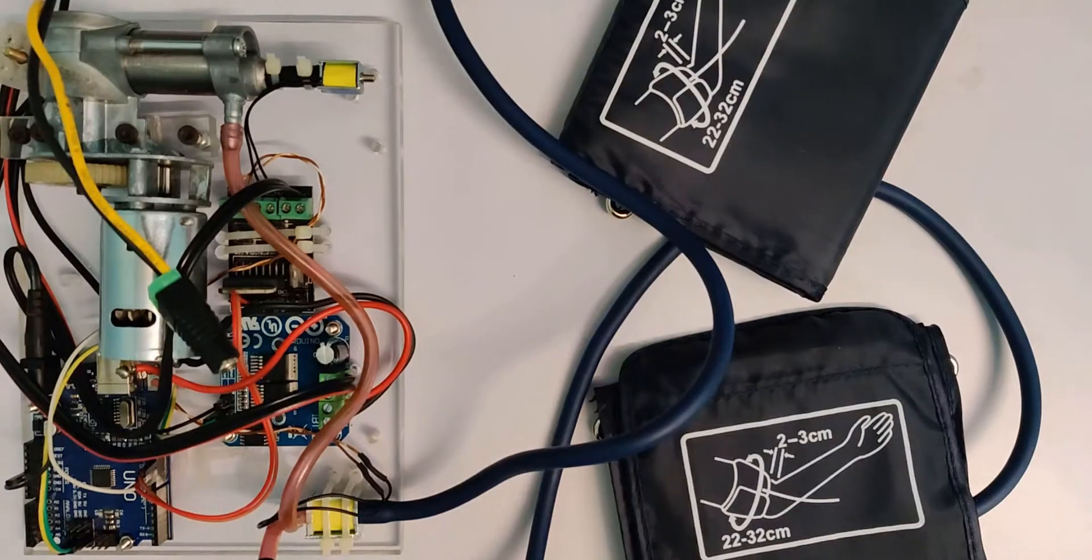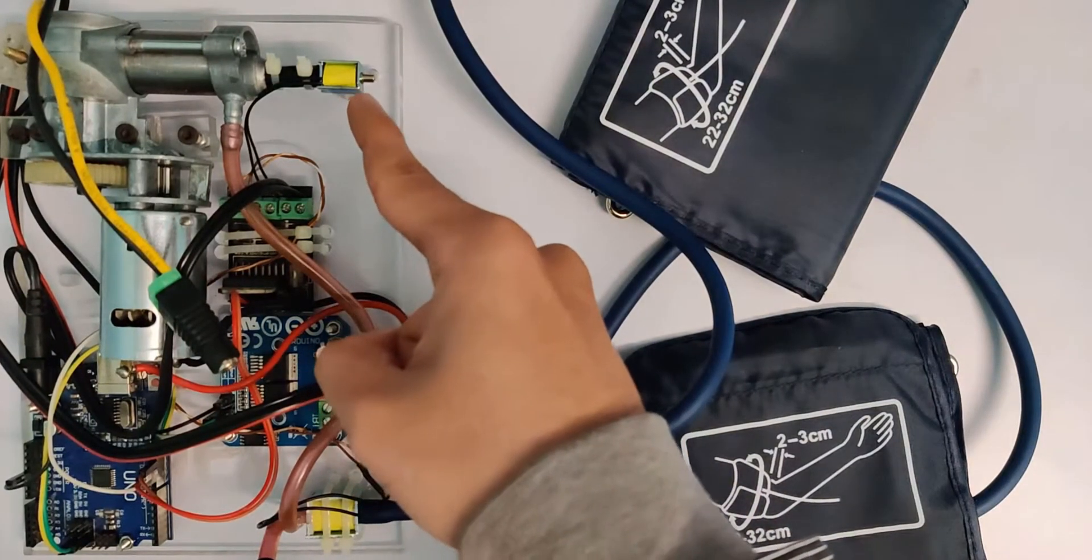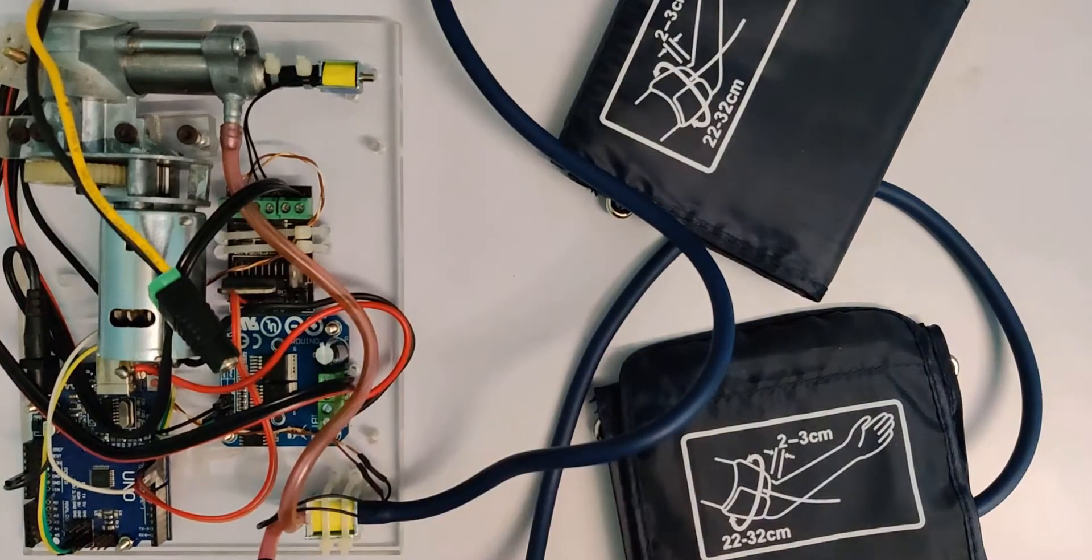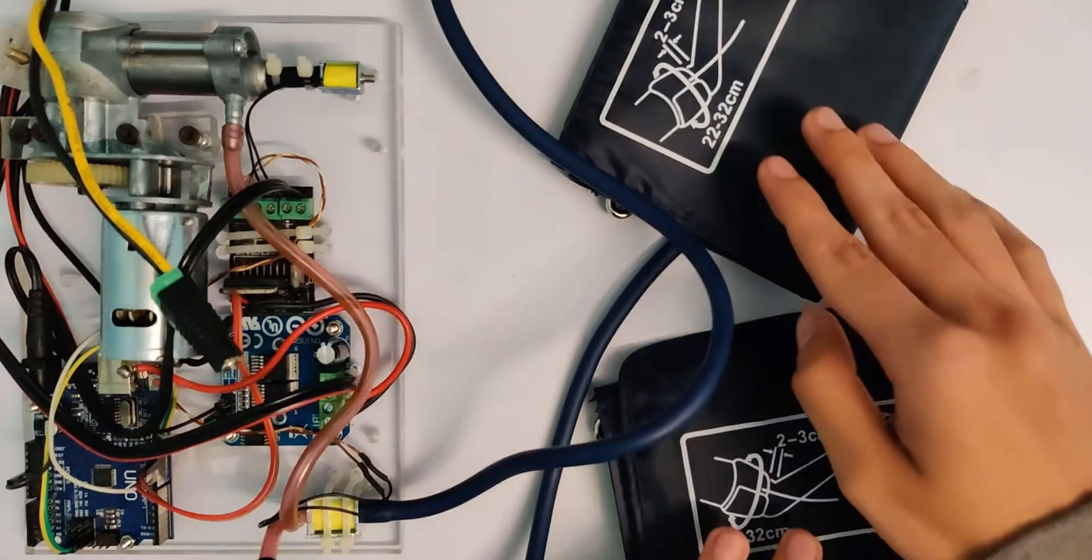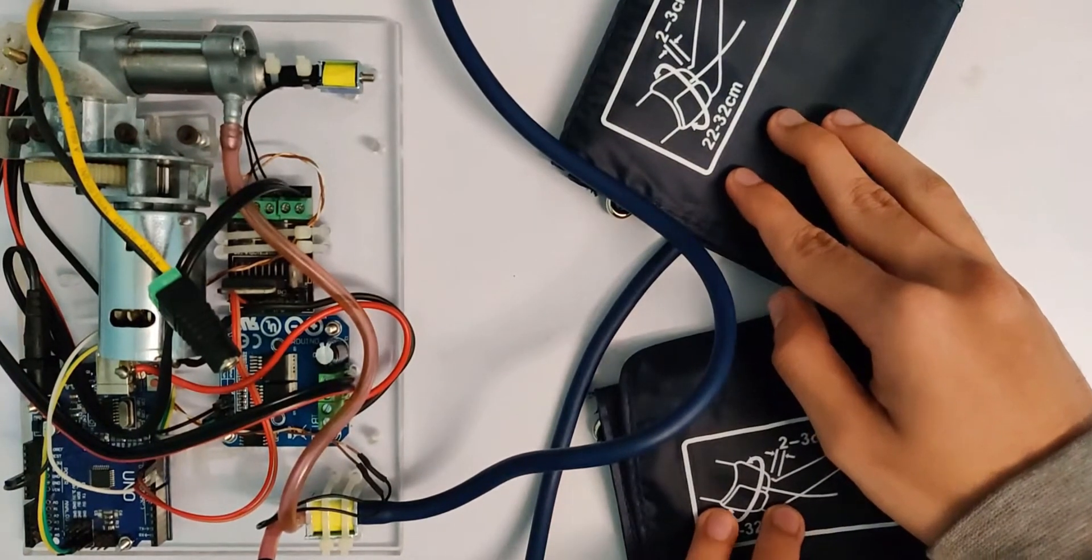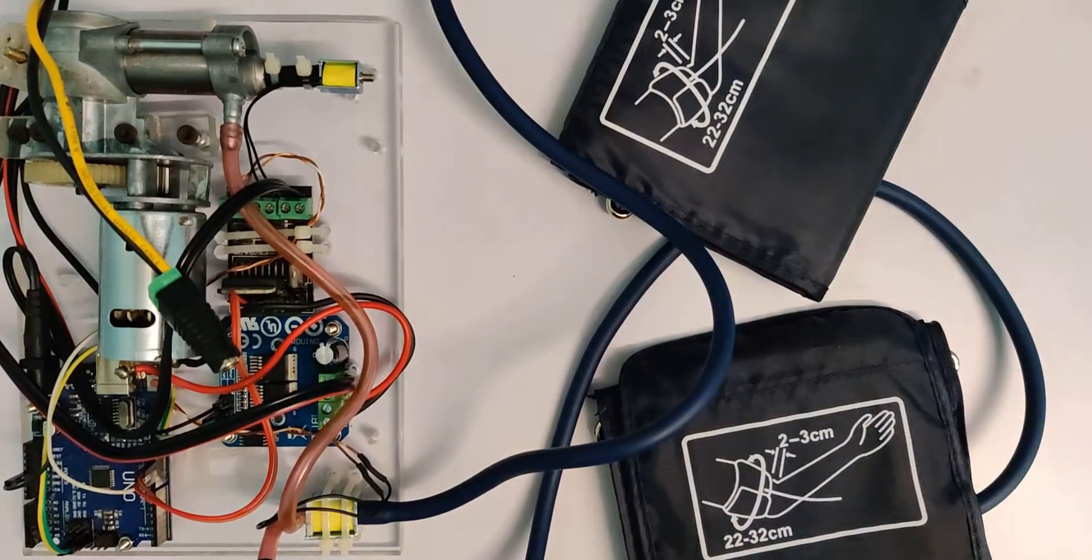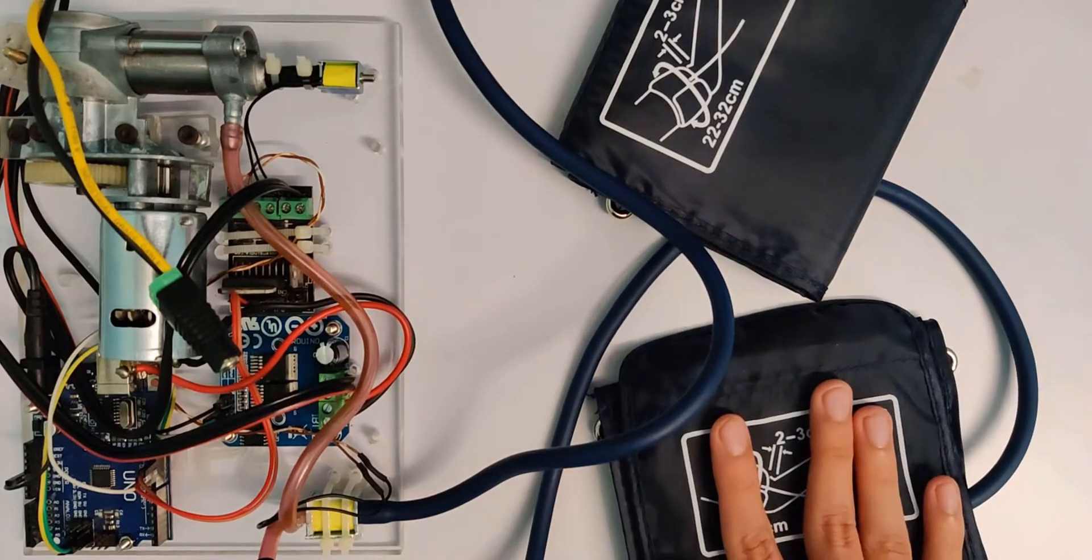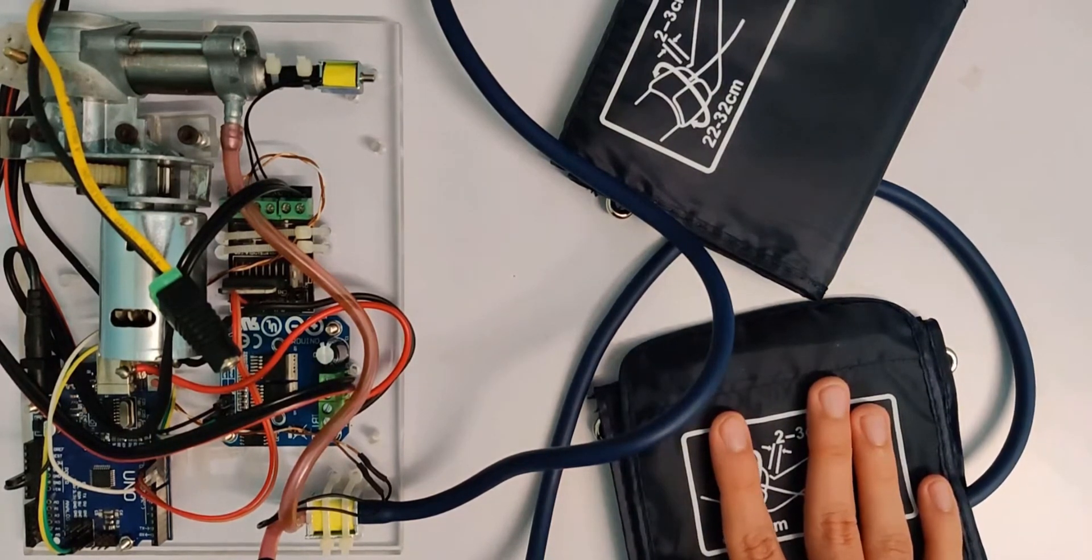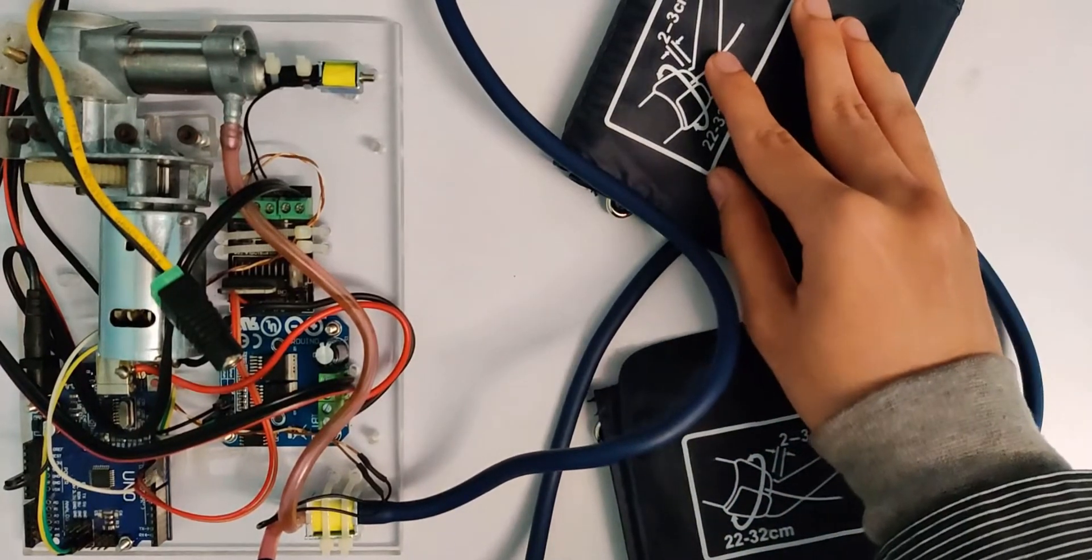When I turn it on, this valve will open for 20 seconds for the first time so that all the extra air inside these two cuffs can come out and you can wear them properly. Then after that it will inflate the first cuff for 2.5 seconds and then switch to inflate the second cuff for 2.5 seconds.